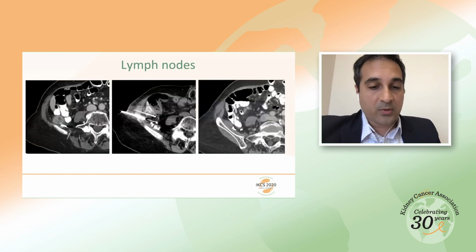So as an example, this is a patient with a retroperitoneal lesion, and as you can see, it's immediately adjacent to several loops of bowel. However, we're able to displace these loops of bowel using saline and carbon dioxide through a needle, and that way we were able to create a safe buffer zone, and we could perform cryoablation of the target lesion. And in such a way, we were able to achieve excellent local control of that lesion with it essentially completely involuting while preventing any injury to the adjacent bowel.